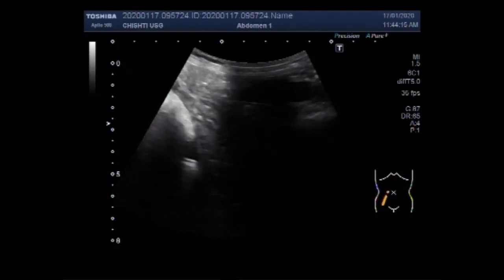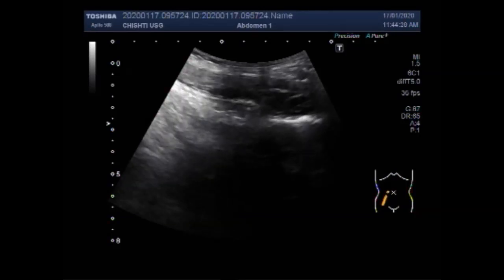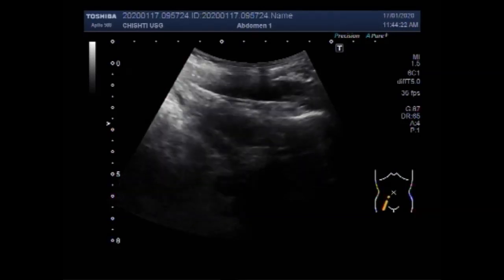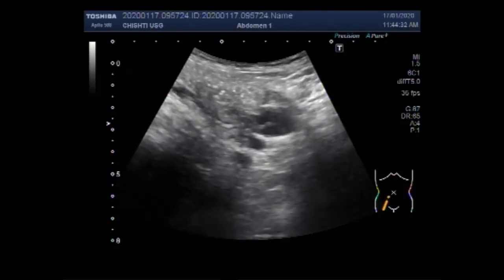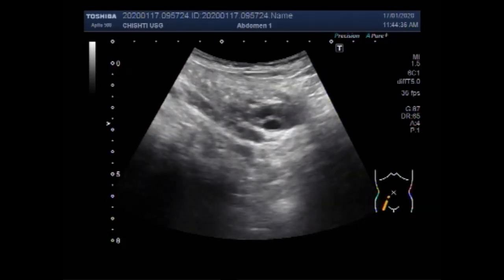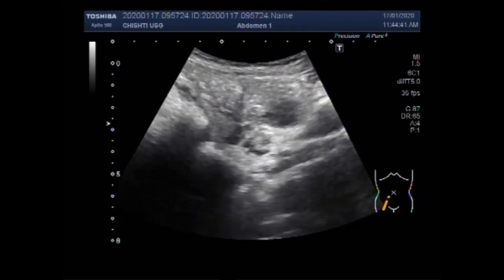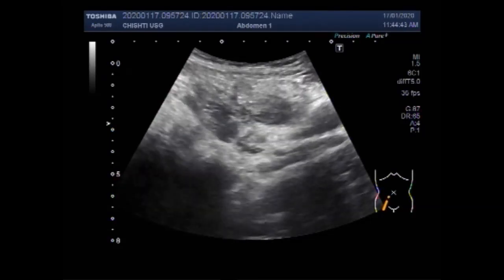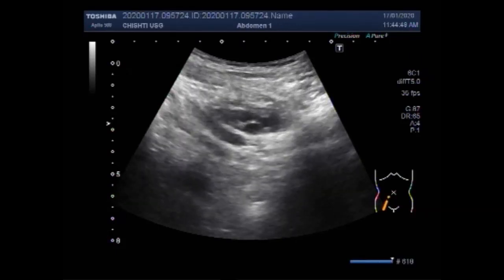Now you keep on focusing the ureter by sweeping the probe downwards towards the bladder, and again you can see the lower one third of the right ureter. A small amount of urine is seen in the urinary bladder. The patient is not well prepared.